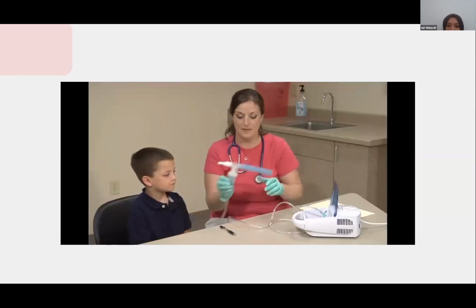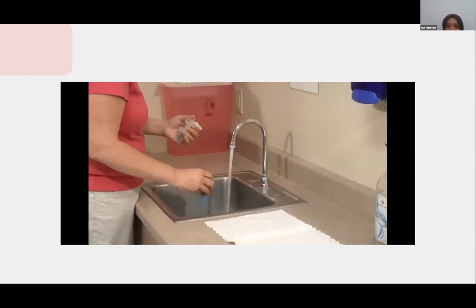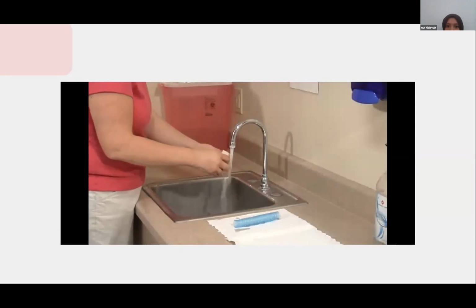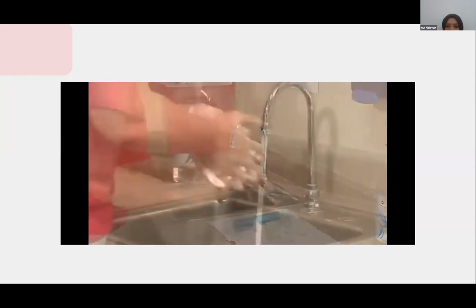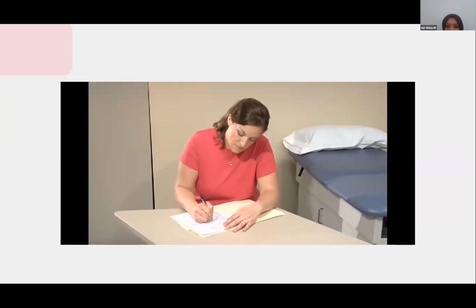Turn off the machine. Remove the mask or mouthpiece. Rinse the nebulizer cup, the mouthpiece, or mask under warm water. Shake off the excess water. Place on a paper towel to dry. Wash your hands. Document the intervention and outcome in the student's healthcare record. Update the parents and healthcare provider if needed.